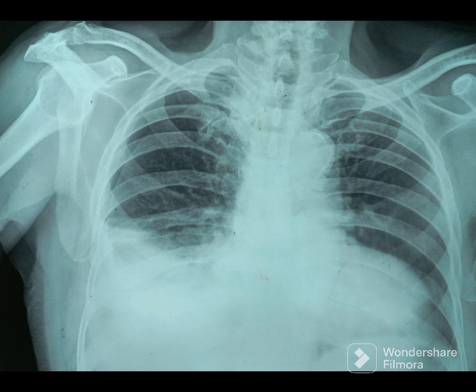Look at the displayed chest X-ray carefully. On closer inspection you can see a small pneumothorax on the right side. Just focus on the right lateralmost aspect of the right hemithorax. You can see a pneumothorax — an area which is devoid of bronchovascular markings.